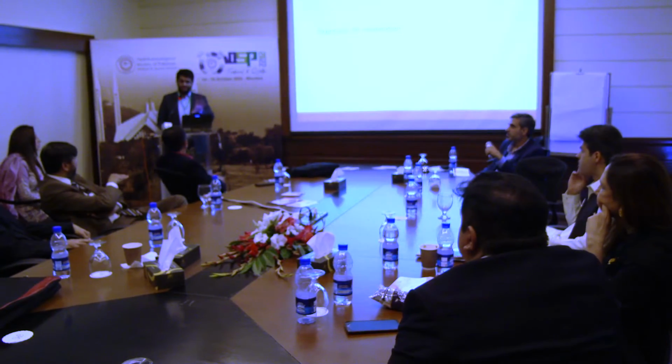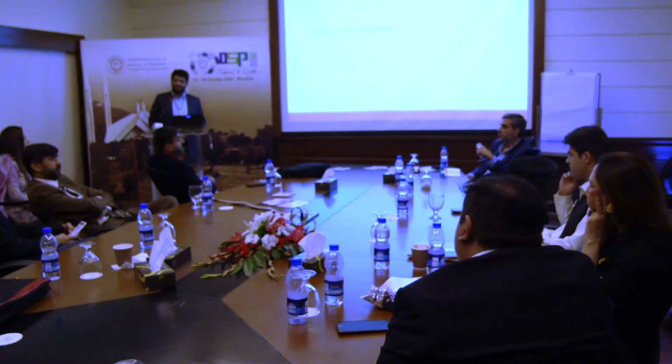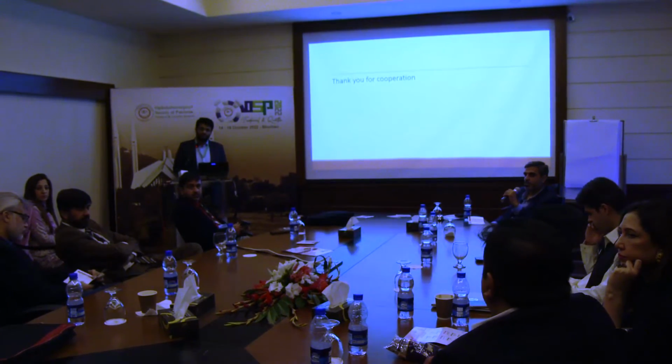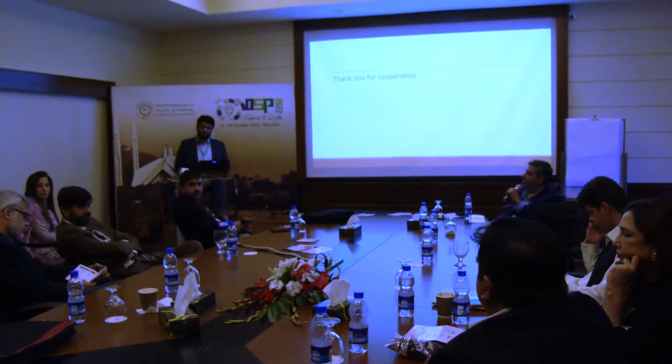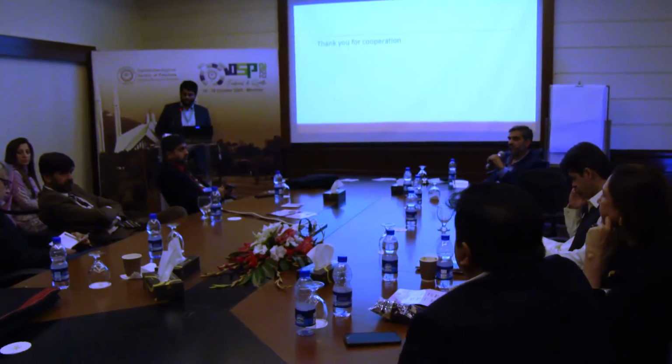Lying position, sitting position, as I have shown in my picture. Mostly I do it in sitting position, and even on the stool where I examine the patient. It is easy to get the picture. It is very handy, very cheap, and you can keep a record of your patient. And a good camera. Thank you very much.